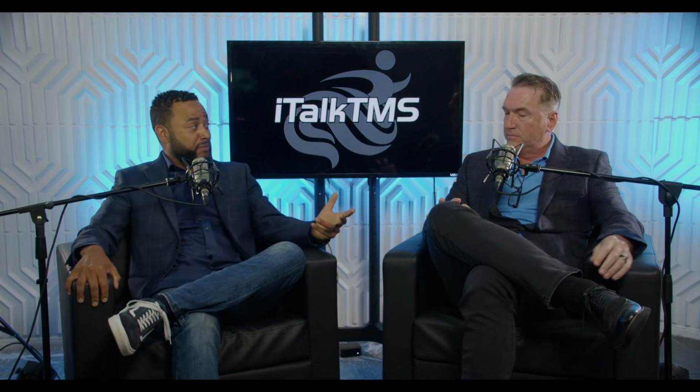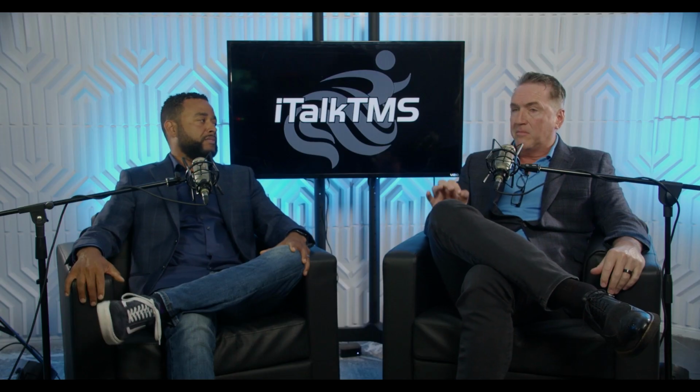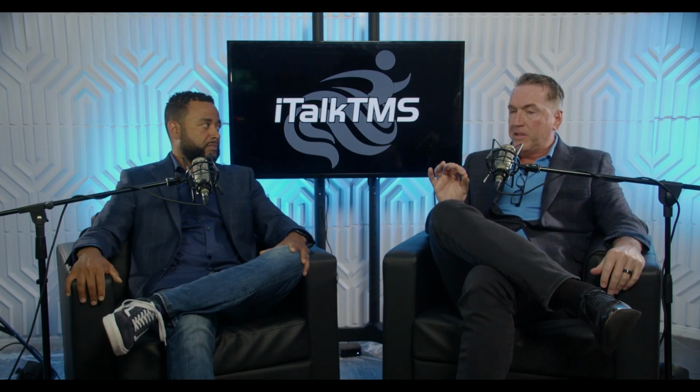Doc, can you tell me a little bit about how TMS actually works? Yes, so TMS therapy is really a microcurrent therapy. We're giving a small magnetic field which gets through the bone into the cortex of the brain and creates a current which can adjust the frequency of the brain in that region. So you're causing a microstimulation in the region of interest where the magnetic field is placed.